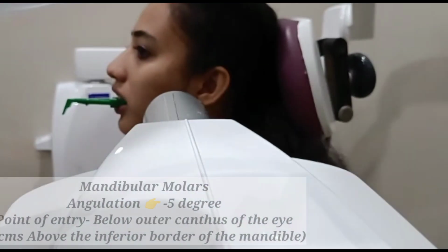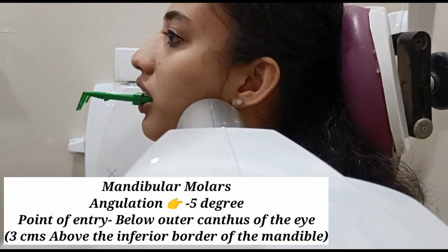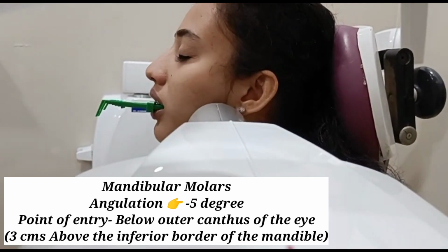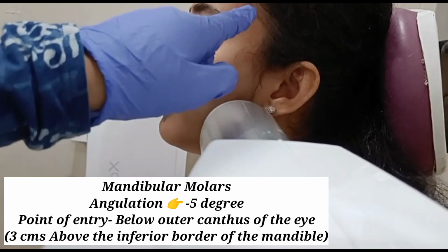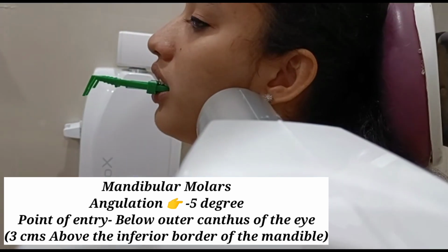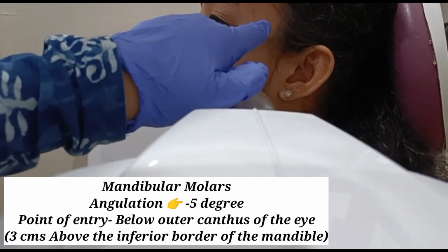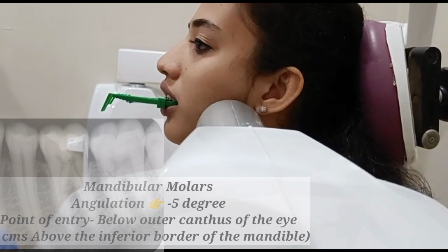The point of entry for the mandibular molars is coinciding below the outer canthus of the eye and 3 centimeters above the inferior border of the mandible. This is how we do the projection for the mandibular molar. So this is how we do it.